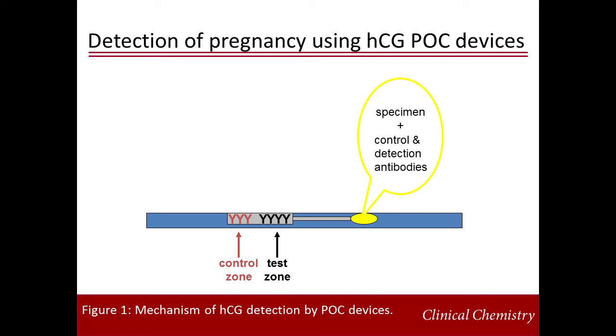Urine was collected for a POC pregnancy test. POC pregnancy tests work by immunodetection of HCG. There is a well for the specimen to be applied, which contains lyophilized antibodies. There is a separate window where the solid phase antibodies are embedded, and the result can be read.